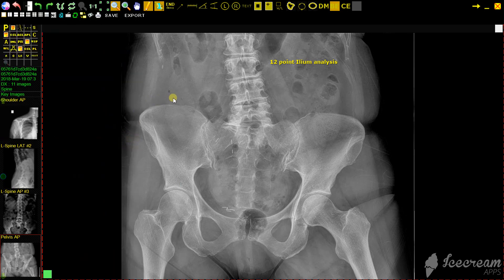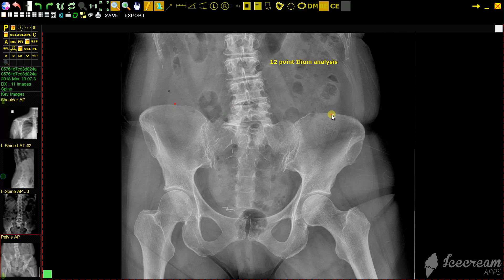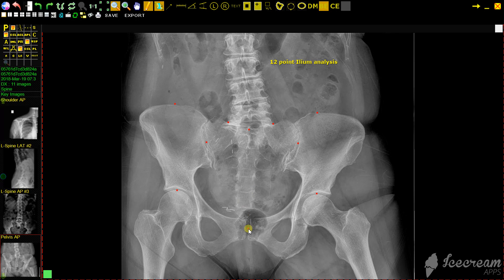We're going to mark left to right, starting with the left upper iliac crest, top of the right iliac crest, left sacral groove, right sacral groove, first sacral tubercle, left lateral sacrum, right lateral sacrum, top of the left femur, top of the right femur, center of the symphysis pubis, lower edge of the left ischial tuberosity, and then the right ischial tuberosity.